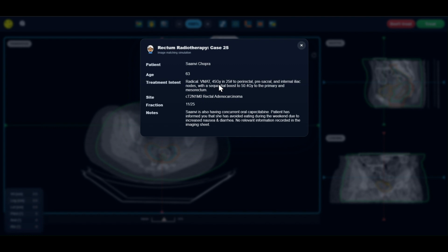So no matter if you're in any other continent, America or Asia, or you're in Europe like I am right now, gray is a standard unit used everywhere in radiotherapy. So when we say 45 grays in 25 fractions, that means the total dose is 45 gray. Okay? So 45 Gy is 45 gray, delivered over 25 separate treatment sessions called fractions. So the patient is expected to come in for 25 days of treatment, or 25 fractions. As I just mentioned, a fraction is simply one individual treatment appointment.